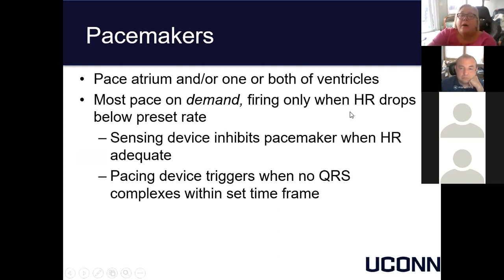Most pacemakers nowadays are what they call on demand. They are, again, complex electronic tools that monitor the contractions of the atrium and the contractions of the ventricle, and only fire when the atrium isn't responding fast enough to its intrinsic stimulus, and only when the ventricle is not responding to its atrial stimulus.